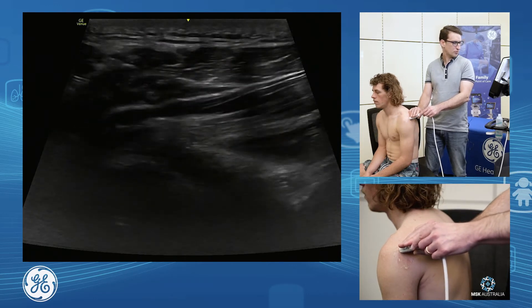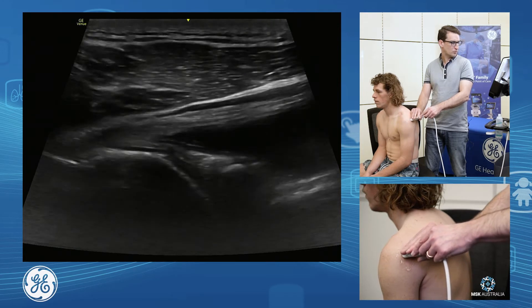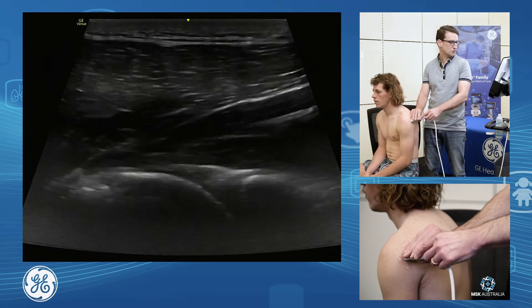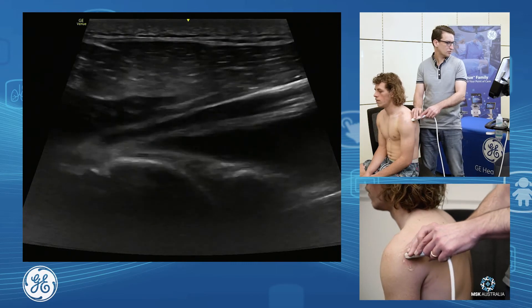I'm going to fan up as far as I can, and then just slide my probe down all the way through to the inferior joint capsule and beyond, just to make sure there's no labral cysts off the bottom. We can see we've assessed the whole way through.